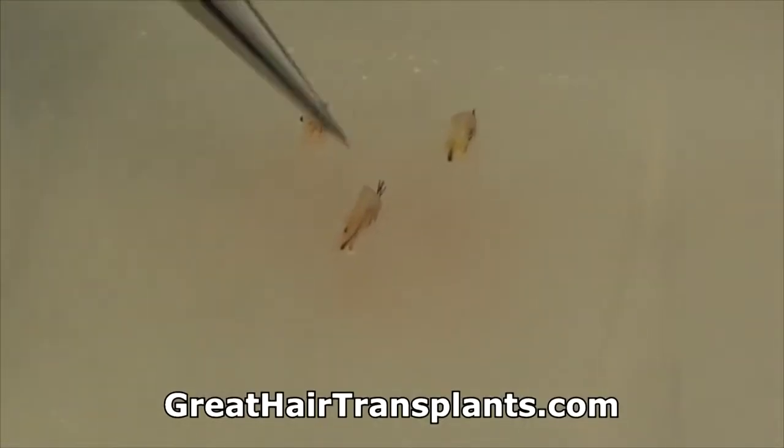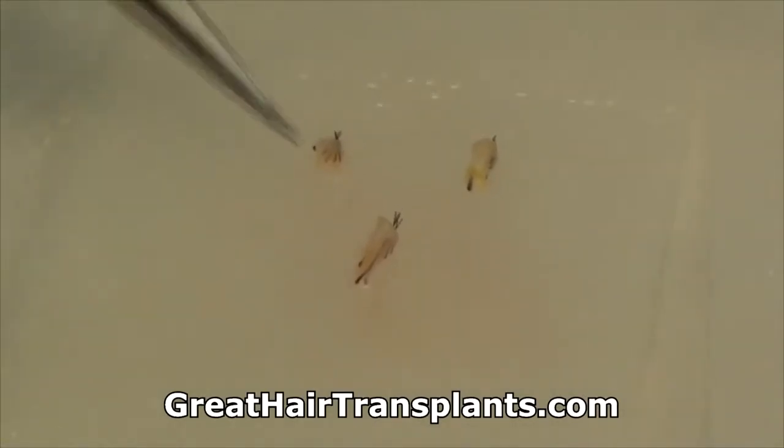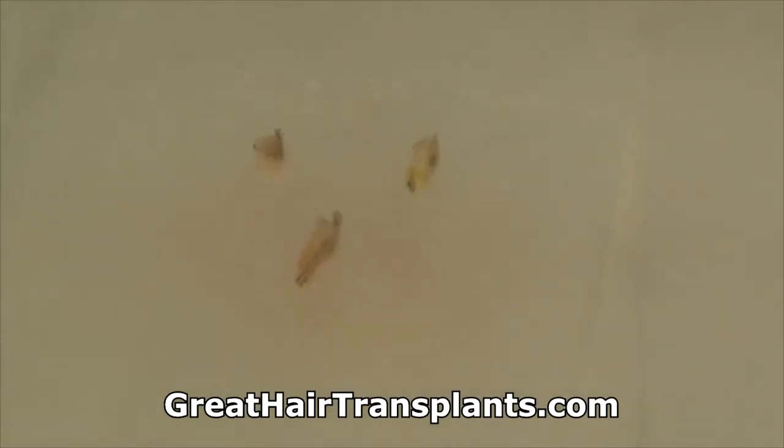So now I tried to pull 3 follicular units out. I got 1 hair here, no hairs there, and 3 hairs there. And how long did that just take? Okay, I just spent 5 minutes trying to do that.